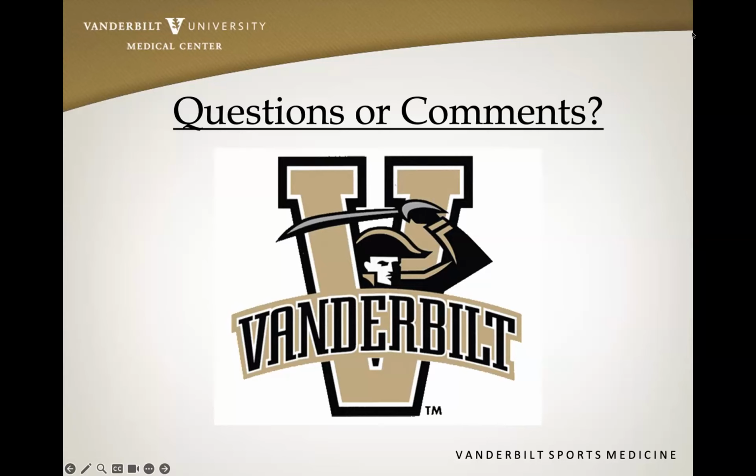And so when you look at those tears, though, measuring the joint width is challenging, and I've always struggled with this. I do it a little bit differently than you, and I don't know what is the right way. I think being consistent is probably the right way. Unfortunately, I don't know if there is a right way. There isn't just too much literature on it when you're looking at this topic to say what should be the standard. Like I said, I think the biggest key is that as long as you're consistent with the way that you measure it, that is always going to be really helpful.